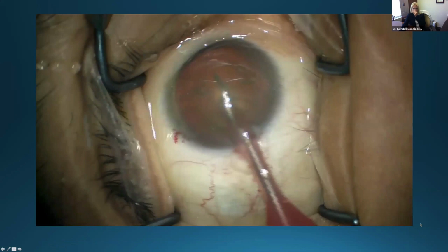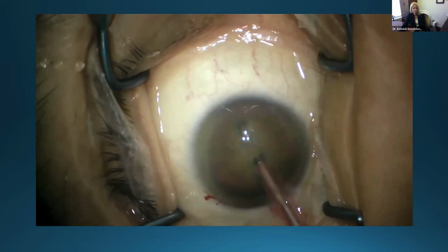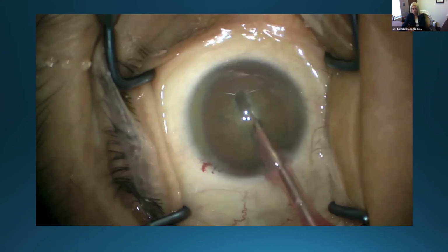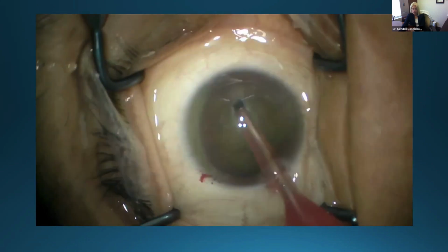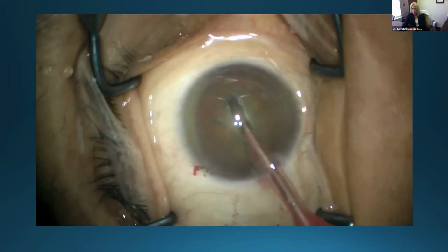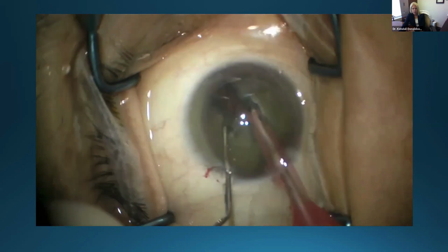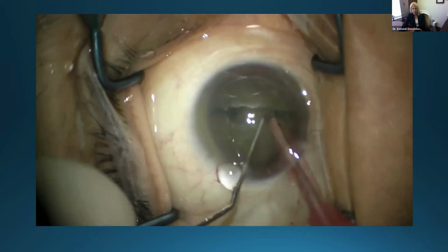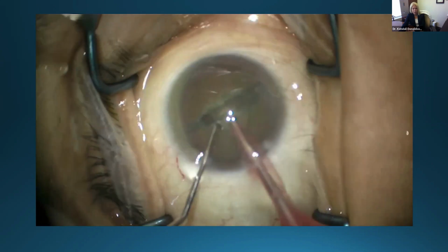This is just a quick example of stop and chop. Okay, so with stop and chop, we have a central groove. So this is a nice transition from divide and conquer to chopping. This is a Nagahara, which I think is safer than that microfinger you just saw David use, but the microfinger works great in his hands.